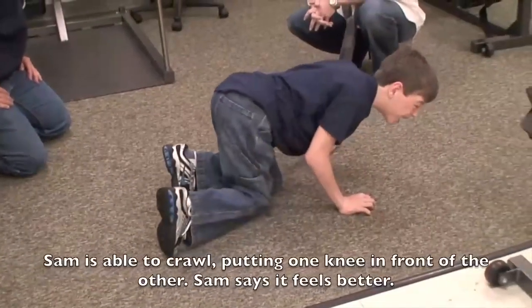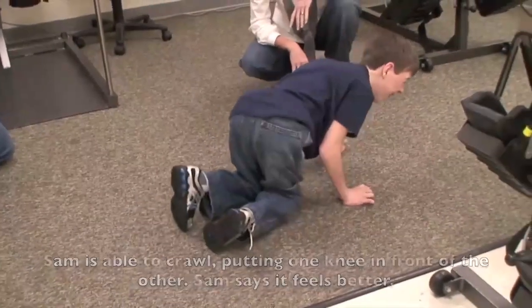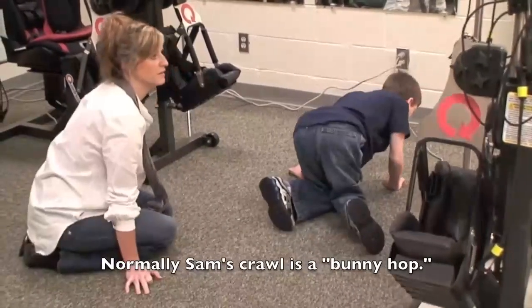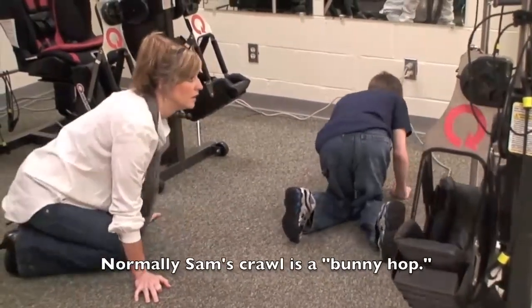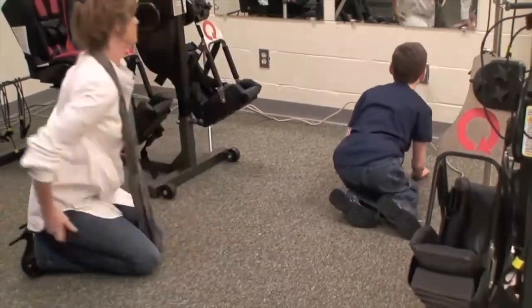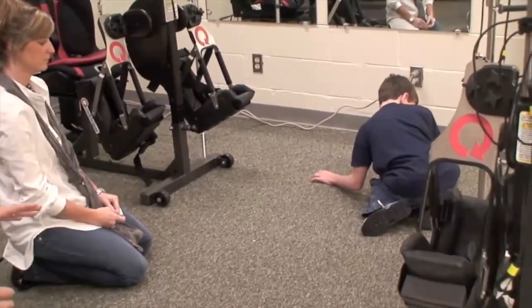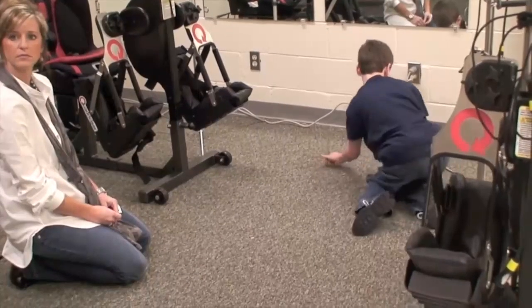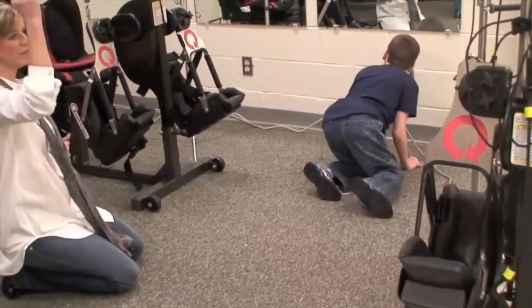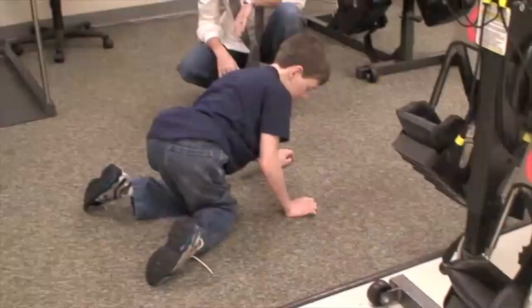He very rarely sits down. His crawl is a bunny hop — he would sit on his bottom and then just hop. They say the most similar movement to walking is reciprocating crawling, where your left hand and right knee, right hand and left knee alternate. When infants do that cross-crawl pattern, they stand up and walk after that. That's what that machine is doing — normally he bunny hops, but the reciprocating crawling was really good.